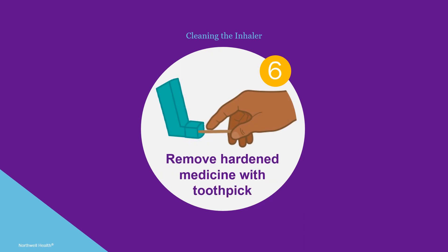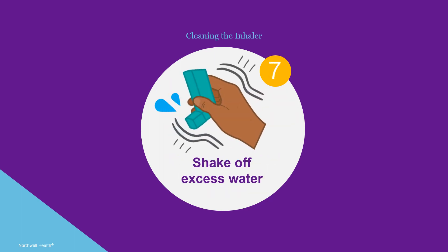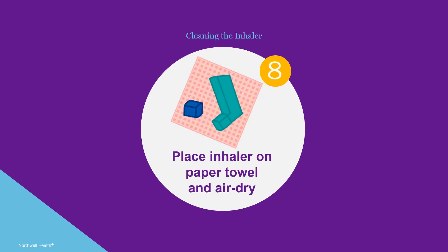If any hardened material is stuck inside the inhaler container, use a toothpick to remove it. Shake any excess water off the container, then place the clean inhaler container and cap on a clean paper towel to air dry. If you have questions, please contact your doctor or pharmacist.